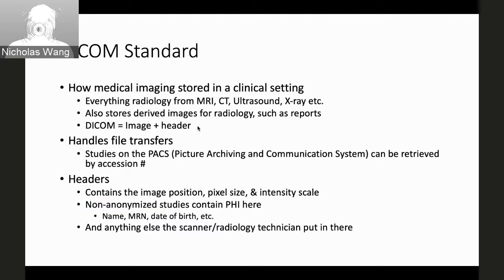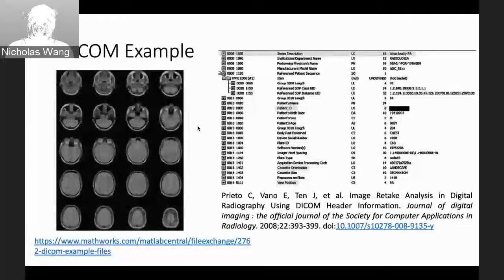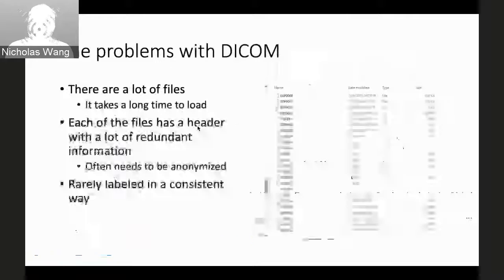I'll give you an example of what some of these DICOMs might look like. This is a head MR; these are examples from MATLAB. This is not the same study, but shows some of what the DICOM tags might look like. On the right, you'll see there are descriptions of where it's taken. This one has an anonymized version of the ID and that sort of thing. But there may be anywhere from 100 to tens of thousands of possible tags that are attached to headers, and they're also dependent on which scanner is used. And so that becomes an issue when you're looking at these.